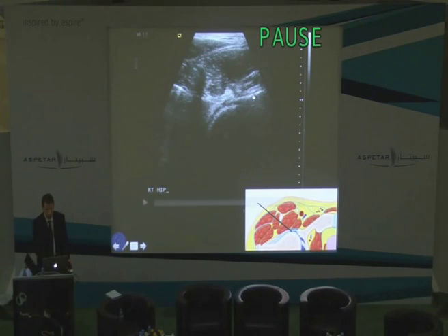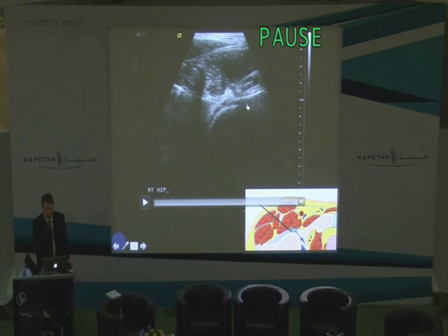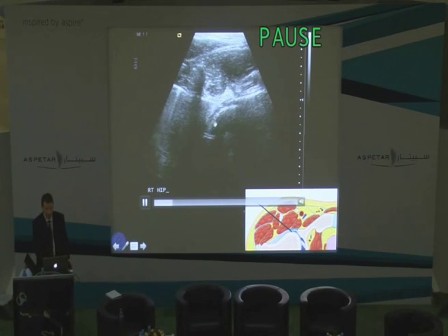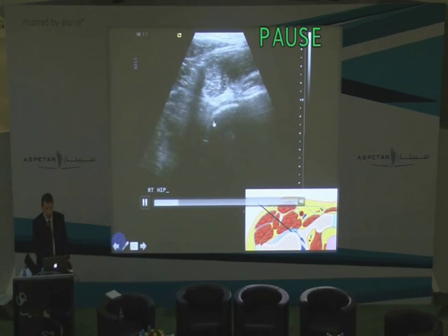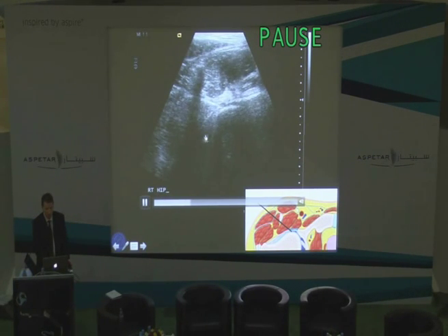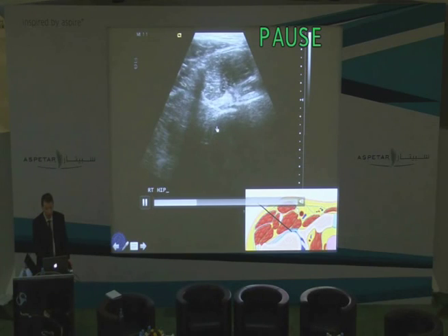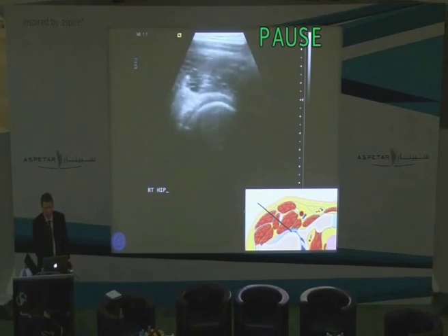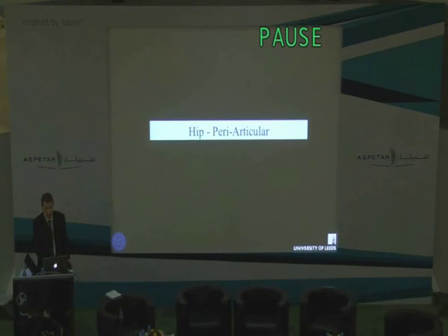Here's an example. This is the femoral head in short axis. You have iliopsoas sitting here, this is the needle coming in. And as I inject, you can see that principle - you can see it flowing away in the head. Air is actually quite helpful in ultrasound. Obviously if you're doing an MR arthrogram you don't want a lot of air, but anywhere else you can see it.